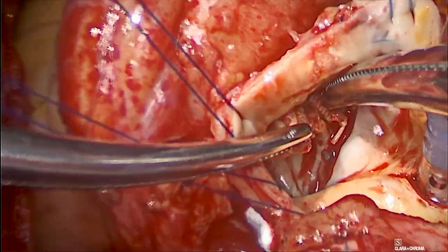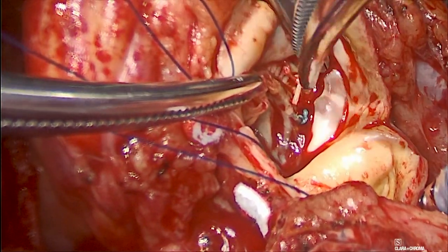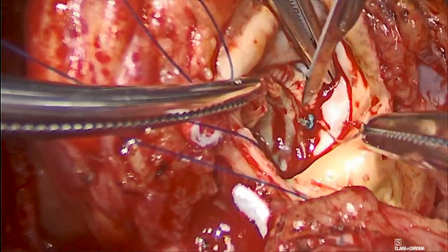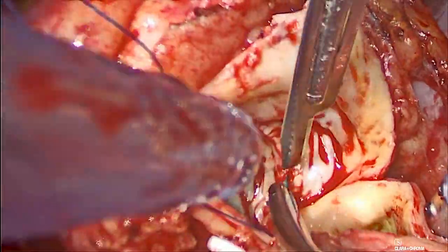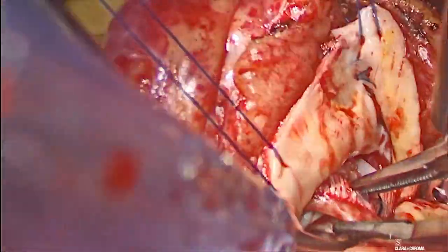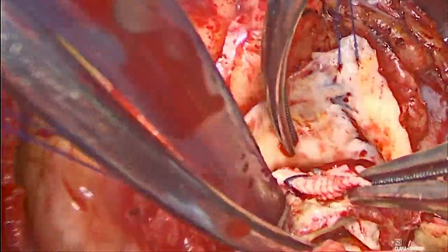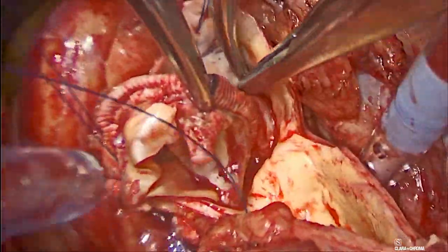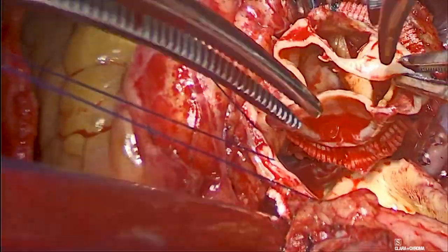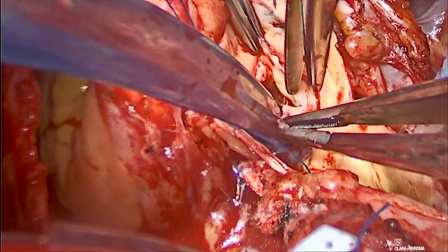Bioprosthetic aortic valve explantation was started by removing all the annular sutures, and the valve was easily explanted. The culprit lesion for aortic insufficiency was then identified as shown.